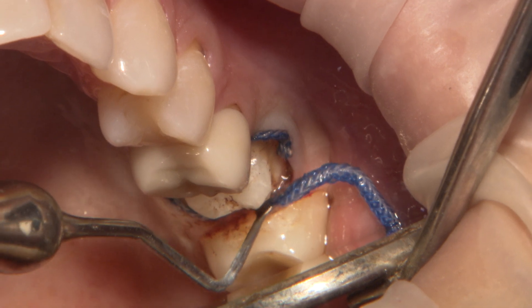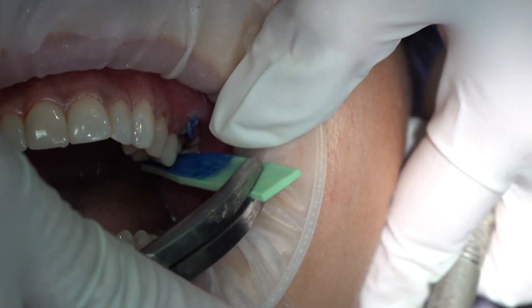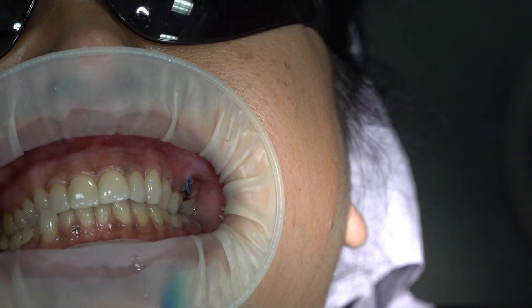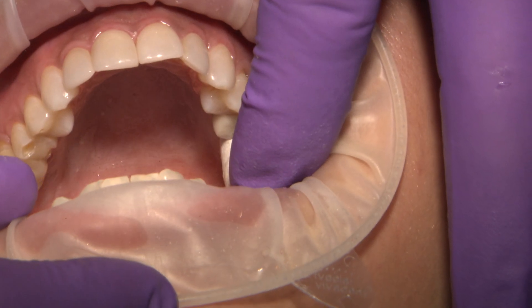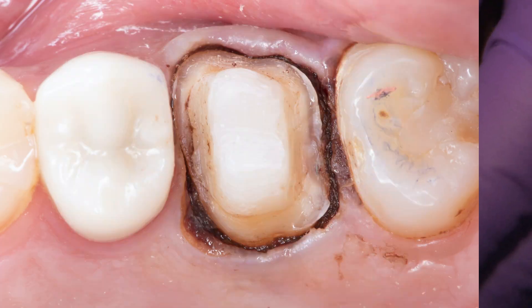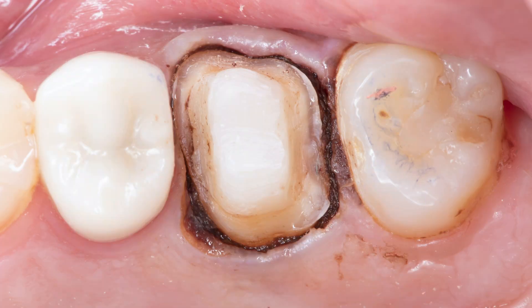A bite tab of 1.5 mm is used to ensure adequate clearance check. For additional hemostasis control, I use Compracab with a minimum of 5 minutes of occlusal pressure prior to scanning.